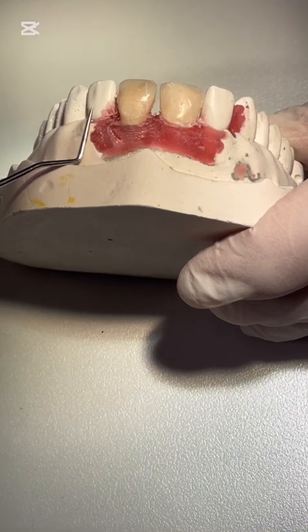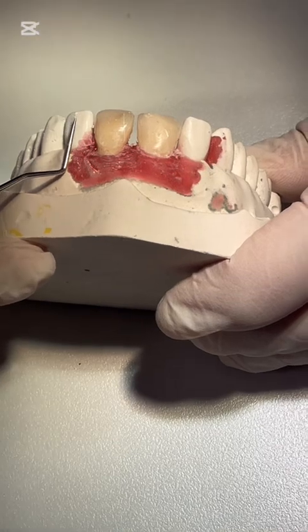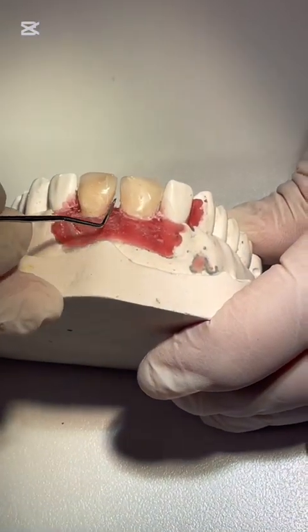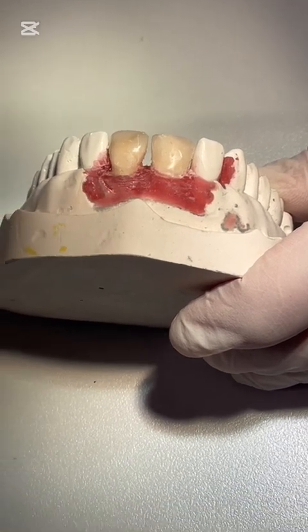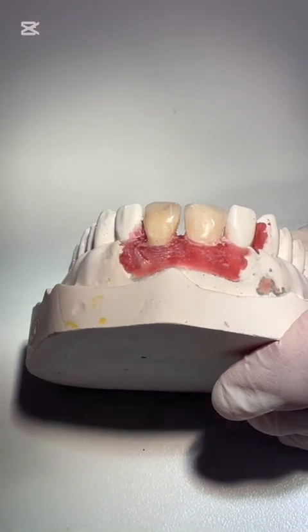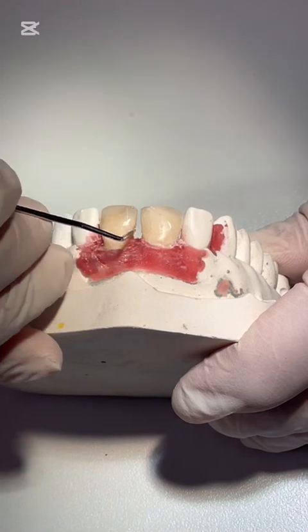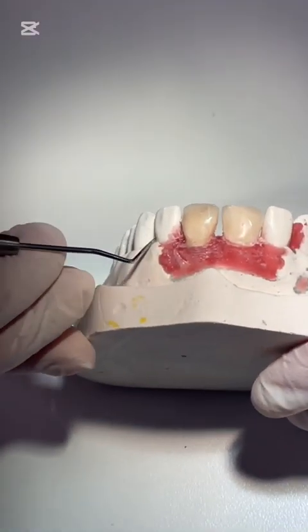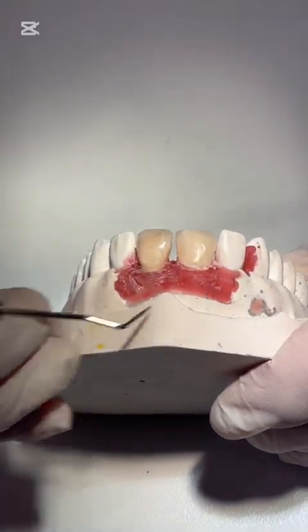this is a choice. But at the end of the orthodontic treatment, do I know if I still have diastema or not? No. So we have to do planning, and now it is done by digital planning, simulating the movement of the teeth, and at the end you can see if you will have a diastema problem or not. And you can evaluate three-dimensionally the area of the implant.